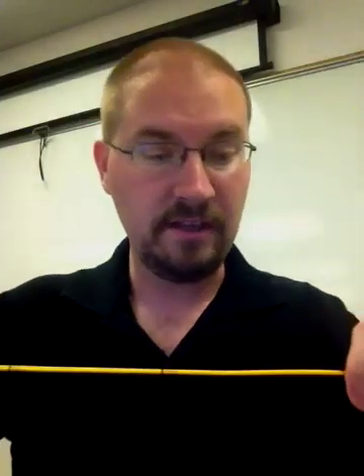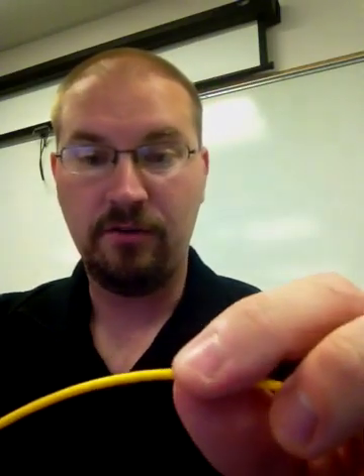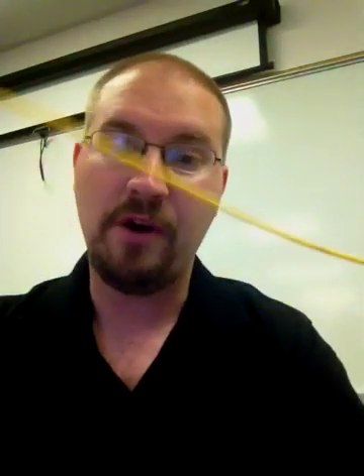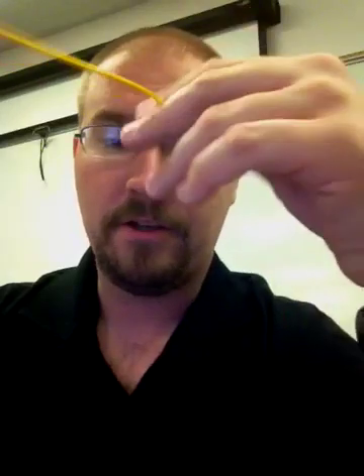You can see there's a distal end here, and I have different lines. We'll talk about the depth markings later, but you have a couple of lines here, several more further down, and continuing all the way. These are approximately 10-centimeter increments — every 10 centimeters you'll see a marking. That gives us an idea of how deep we are, because depending on whether we go through the subclavian or femoral, a certain depth will correspond to a general anatomic placement within the body.